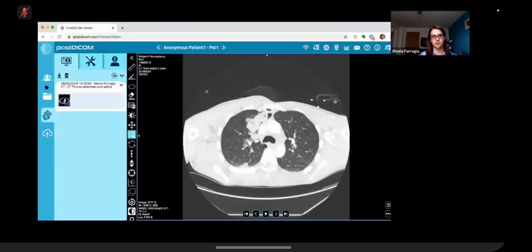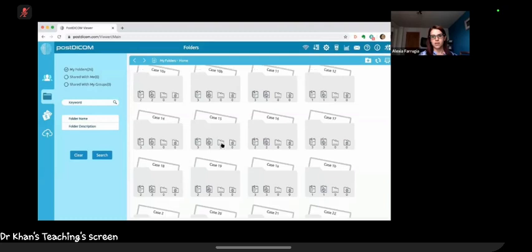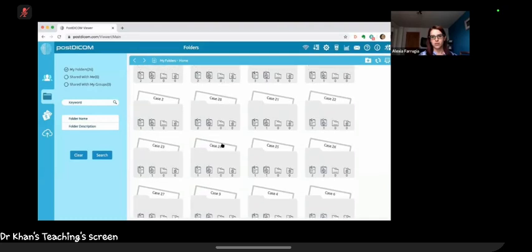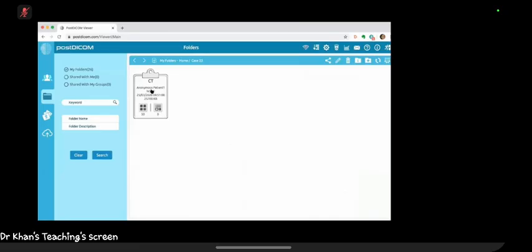Good. And the last case for you, case 23. All right, so the history is a 51-year-old male who presented with chest tightness.